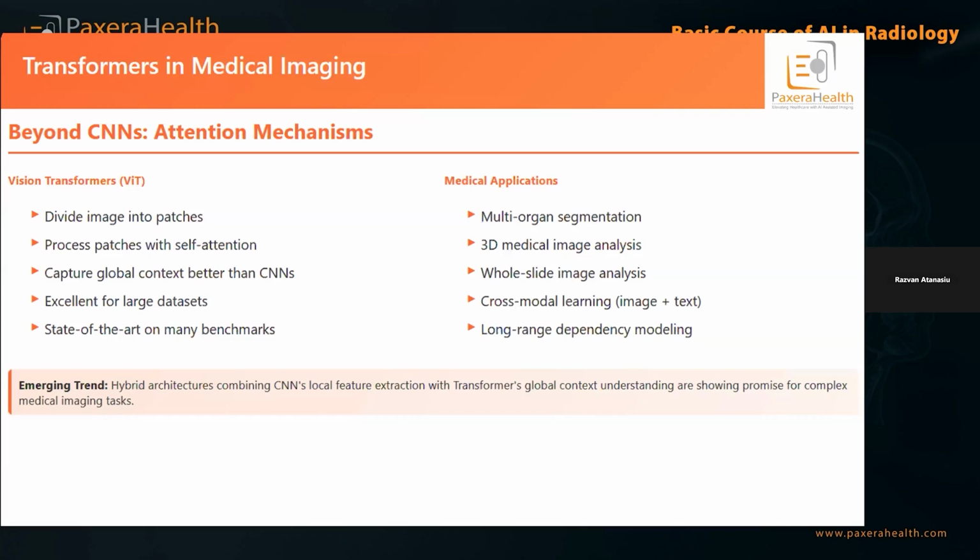So CNNs are, in a way, more focused on medical. They're not necessarily general purpose algorithms, right? You have a problem, you identify your problem, you train it, usually with supervised training, and that's how things work. So, we think that CNNs are still here to stay because they're perfect for medical imaging and vision in general. But as you know, the world was taken by storm by generative AI, right?